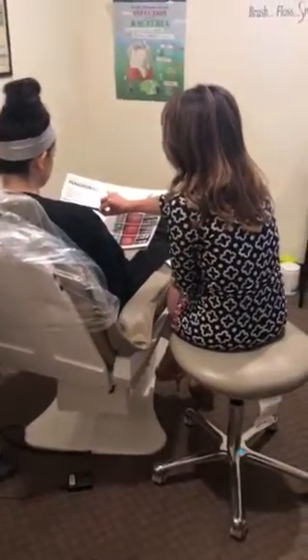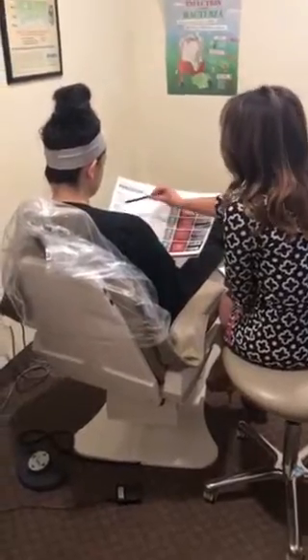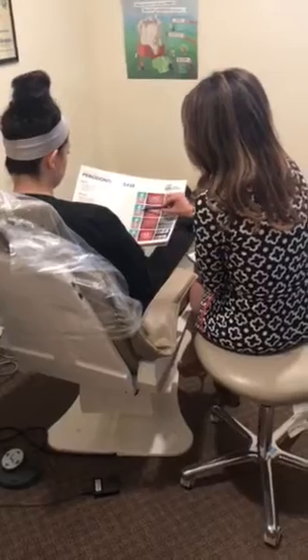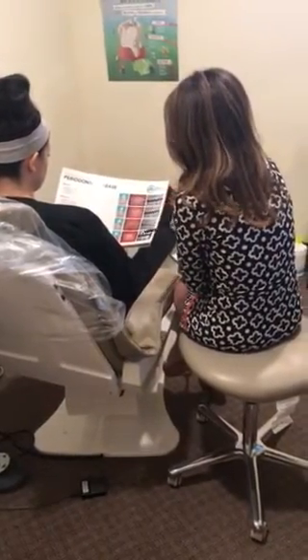Here, but the most important thing that's happening here is we actually have an infection, a bacterial infection, and so we see bleeding when we touch that tissue. So we drop down in here with our ruler. You're gonna see that this may be real red. When we touch this, it's bleeding.